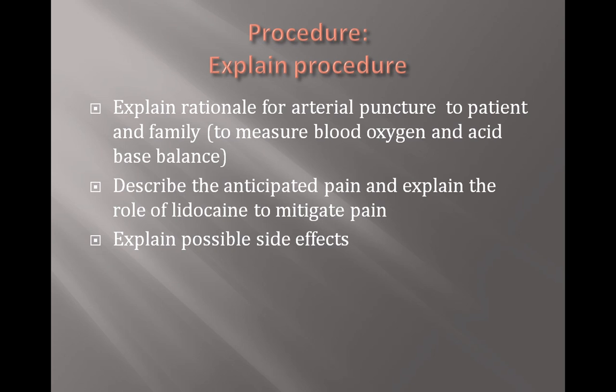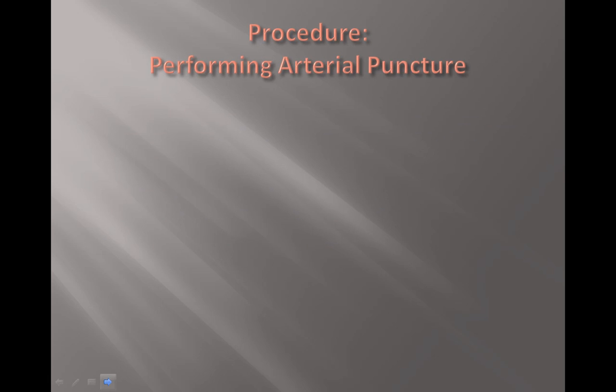Briefly review any side effects. The primary ones are pain, bleeding, and infection. Reassure the patient that you've taken all the actions necessary to mitigate any and all of these risks. And now you're ready to get on with the procedure.